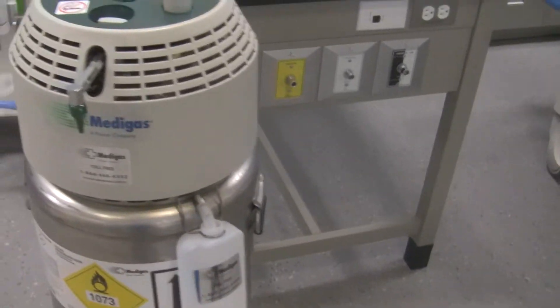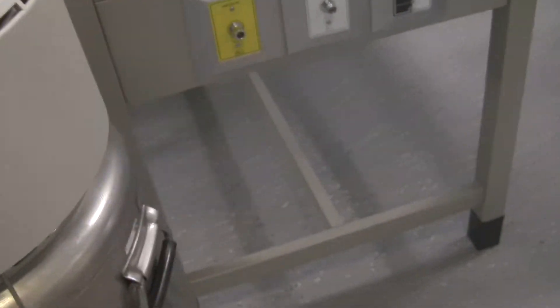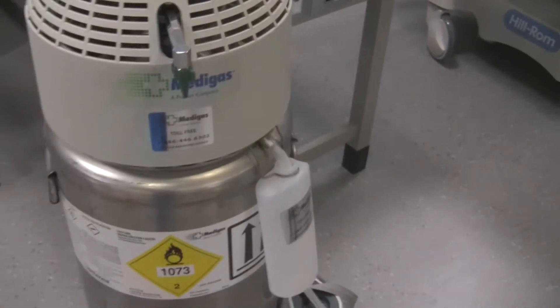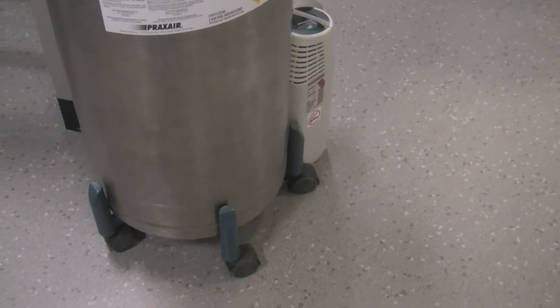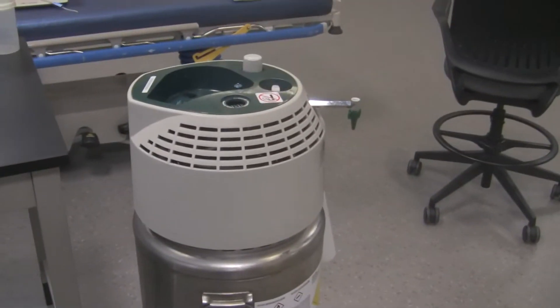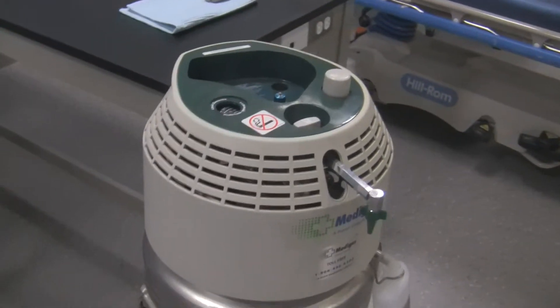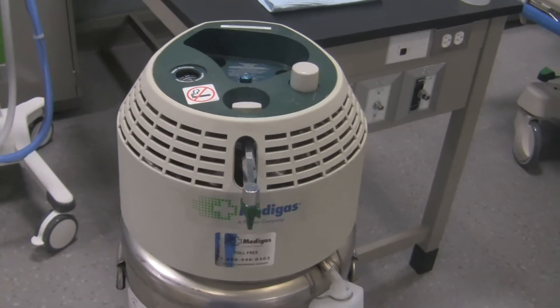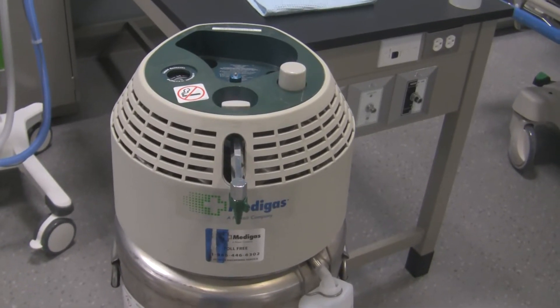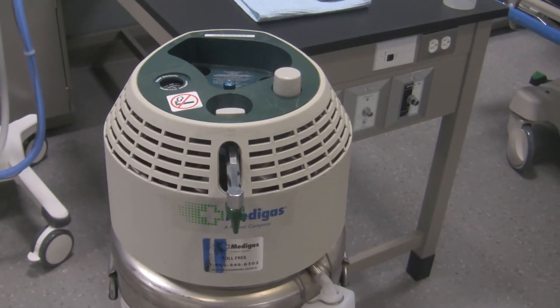On both sides of the tank you'll notice a set of handles for lifting the unit, but don't try to lift it when it's full because it's very heavy. It also has a dolly or transport mechanism with casters so you can transport the stationary unit and locate it in a safe place for your patient. That is the reservoir of liquid oxygen, which you'd use either for oxygen administration directly to your patient or to fill the portable from.